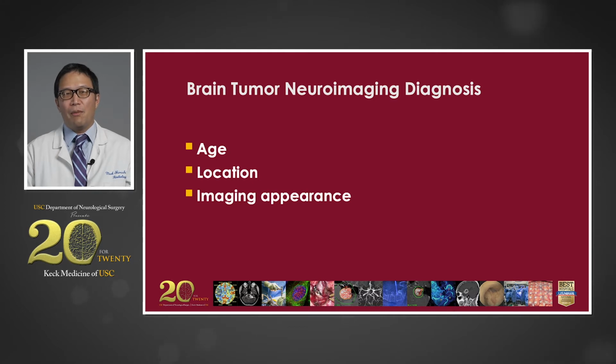So first we'll be talking about brain tumor diagnosis using neuroradiology. There are certain basic concepts that have stood the test of time, including information about a patient's age, the location of the lesion, and the imaging appearance.